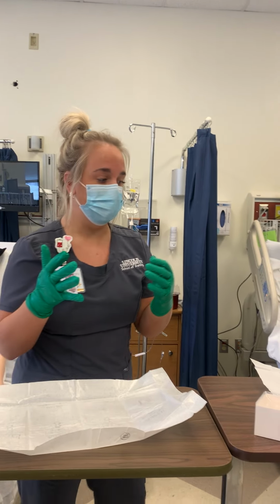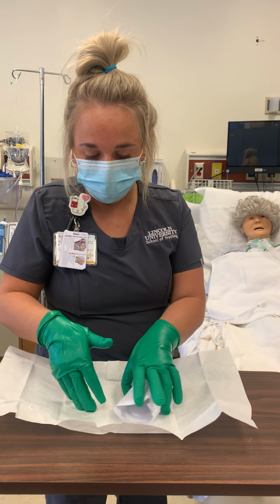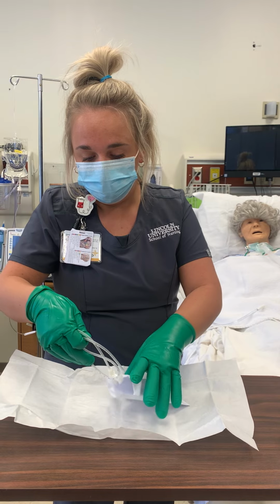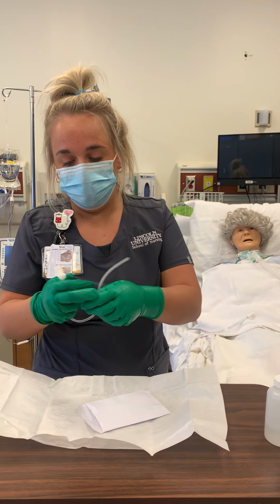Okay, now that I'm sterile, I'll move back over here. And I can go ahead and get my catheter out of my kit. Okay.